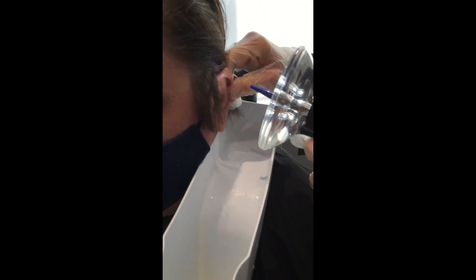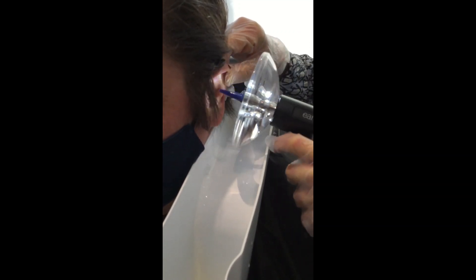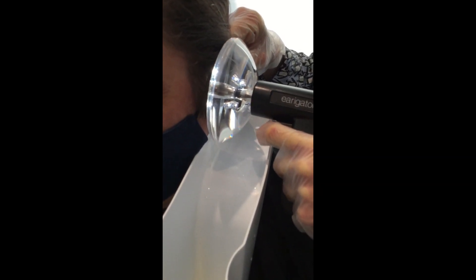We're just going to get your head straight — perfect. Are you ready? I'm ready. Okay, here we go. You might just feel the wax move out a bit. If you're going to move, just let me know before you do. Okay, here we go.